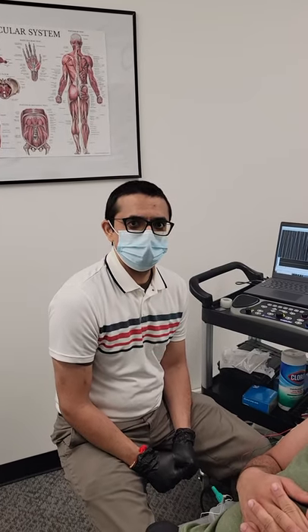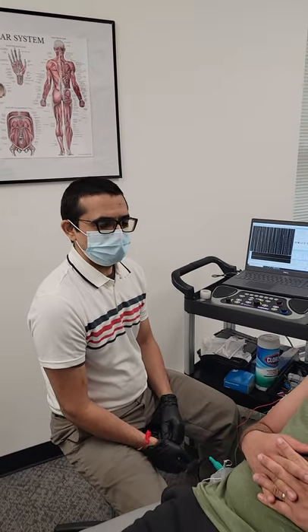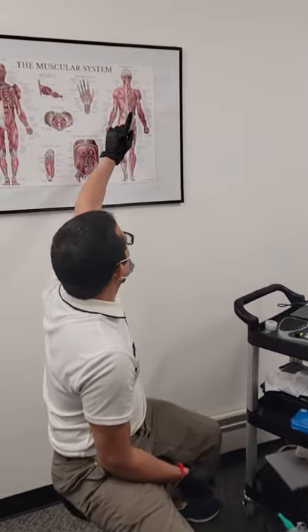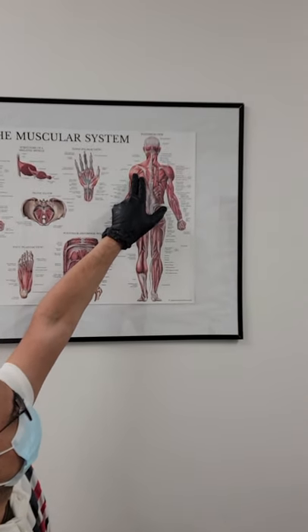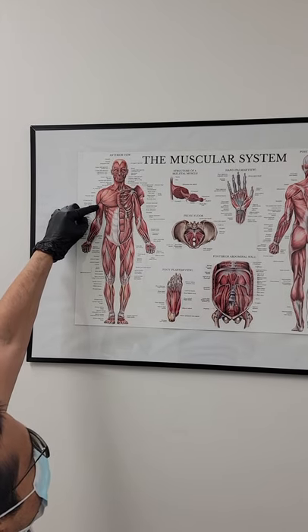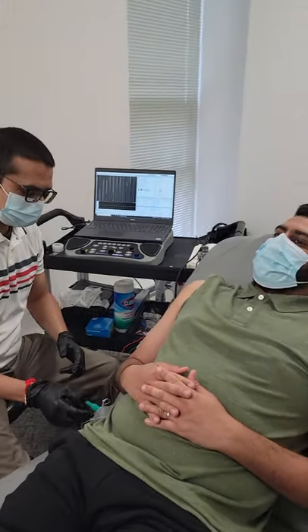Today we will perform the needle EMG on Dr. Bihang, demonstrating on the deltoid muscles. If you see here from the back side of the shoulder, and from the front and the side — this is the area of the muscles where I'm going to perform the needle EMG studies.